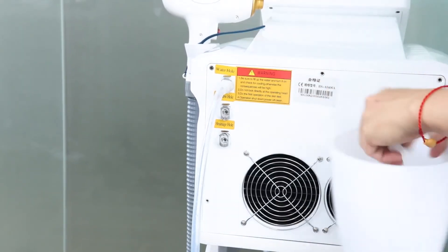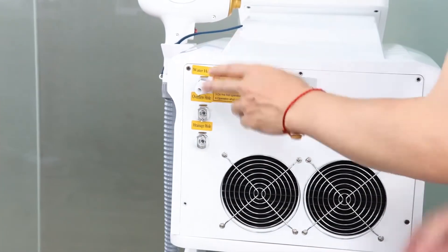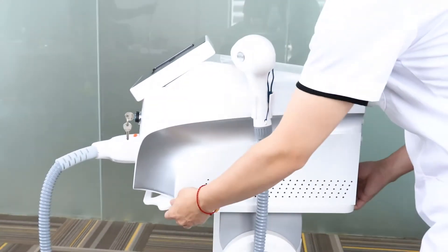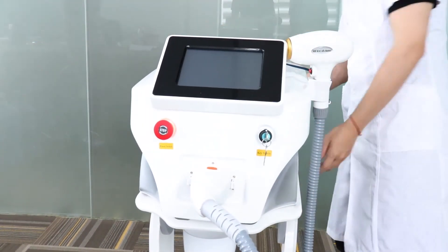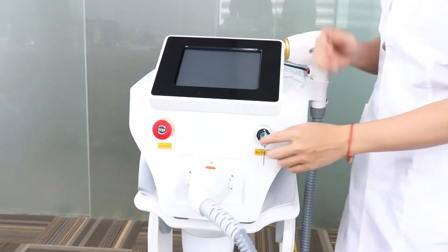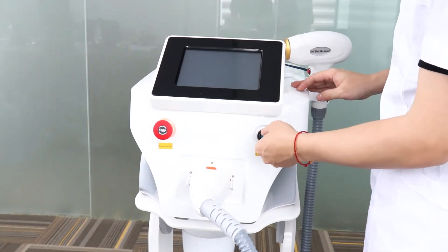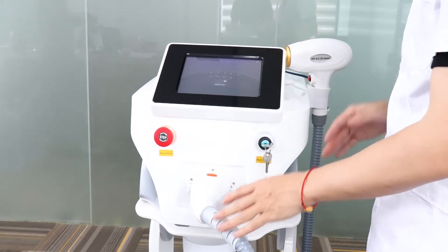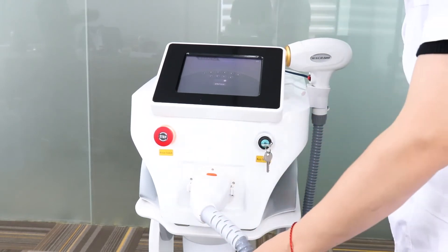Now we turn on the machine to check its status. Turn the machine back, connect the power on the back, and turn it on. Put the camera closer to check the screen. Now it's on. When you turn on the machine, you hear sounds from the machine — that's the water circulating from the tank to the handle.